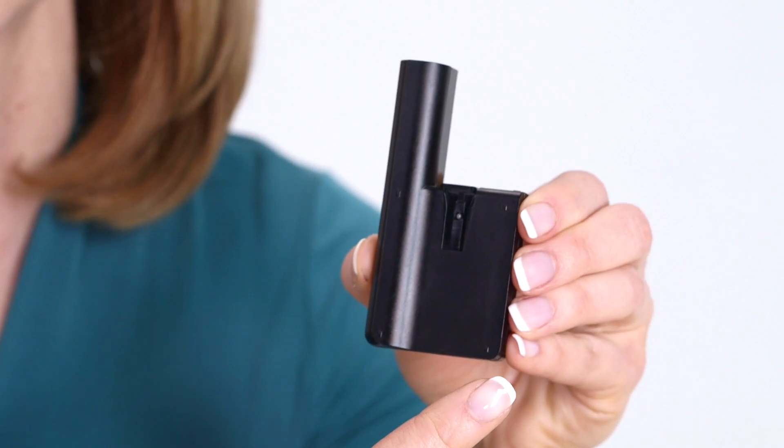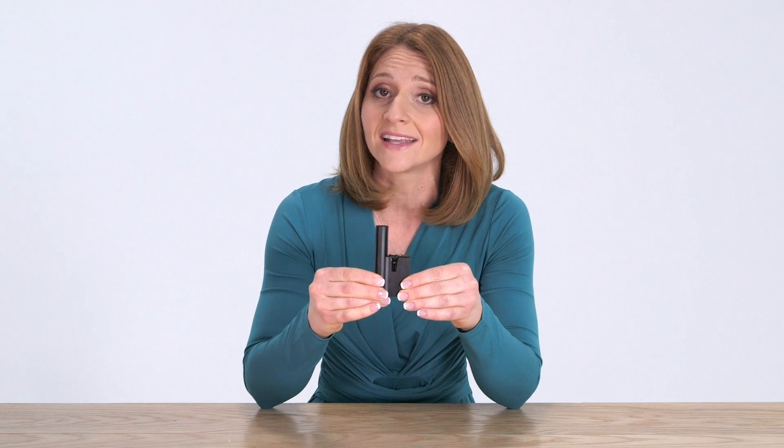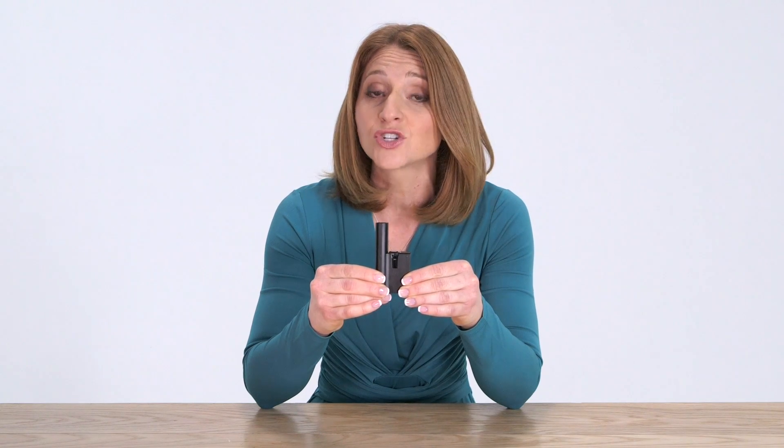The pump body also contains its own battery, which means that you never have to change the battery, purchase a new one, or charge the battery. You get a fresh battery each time you change the pump body.